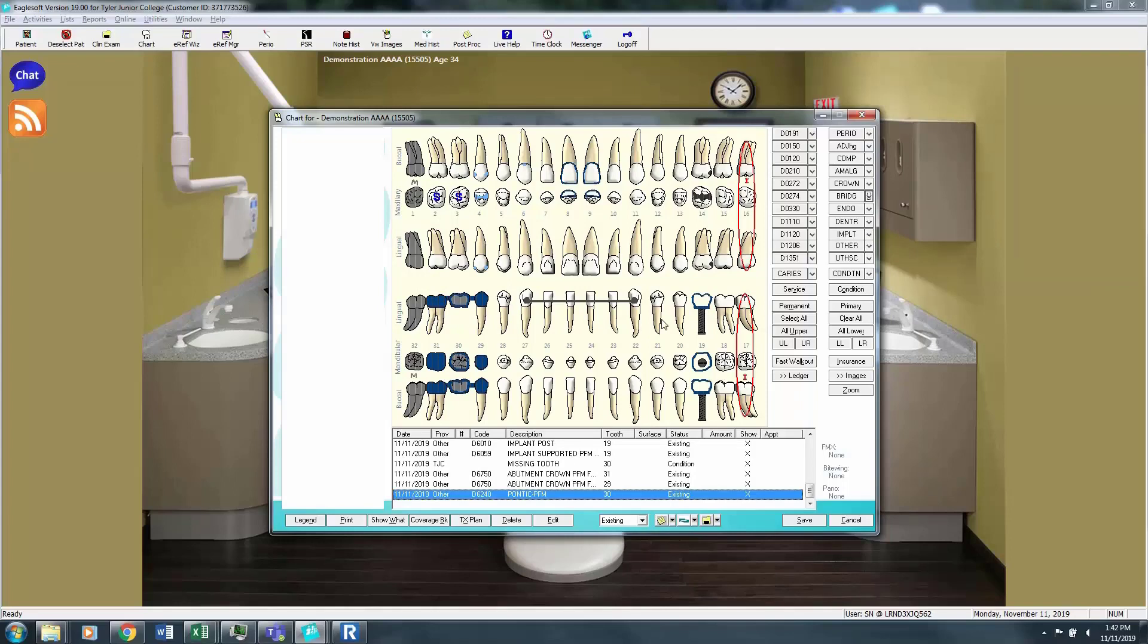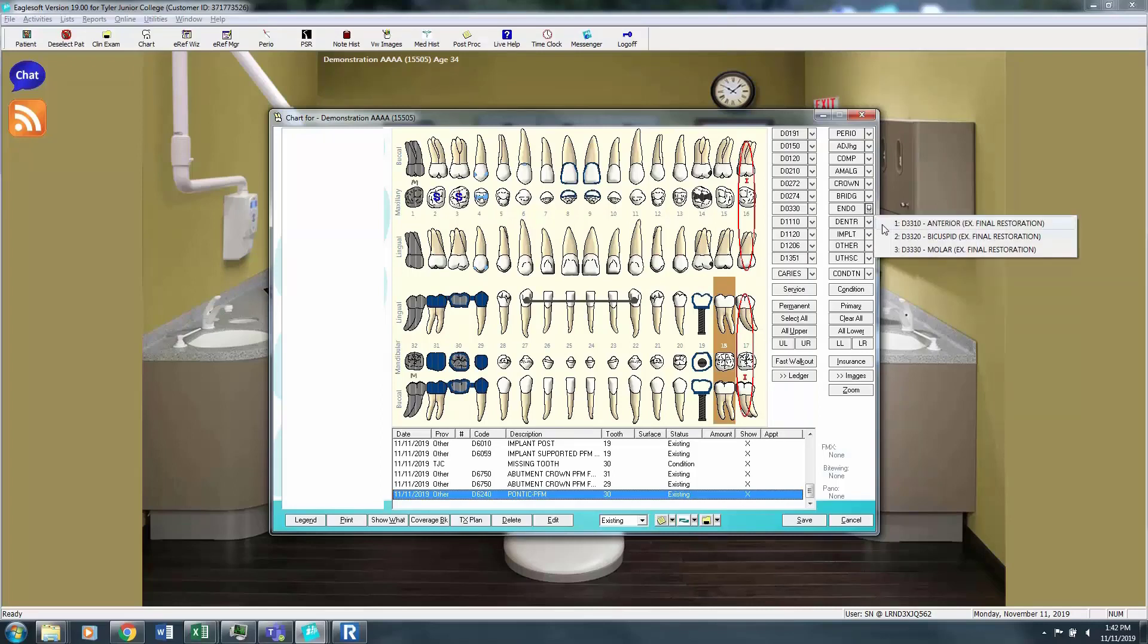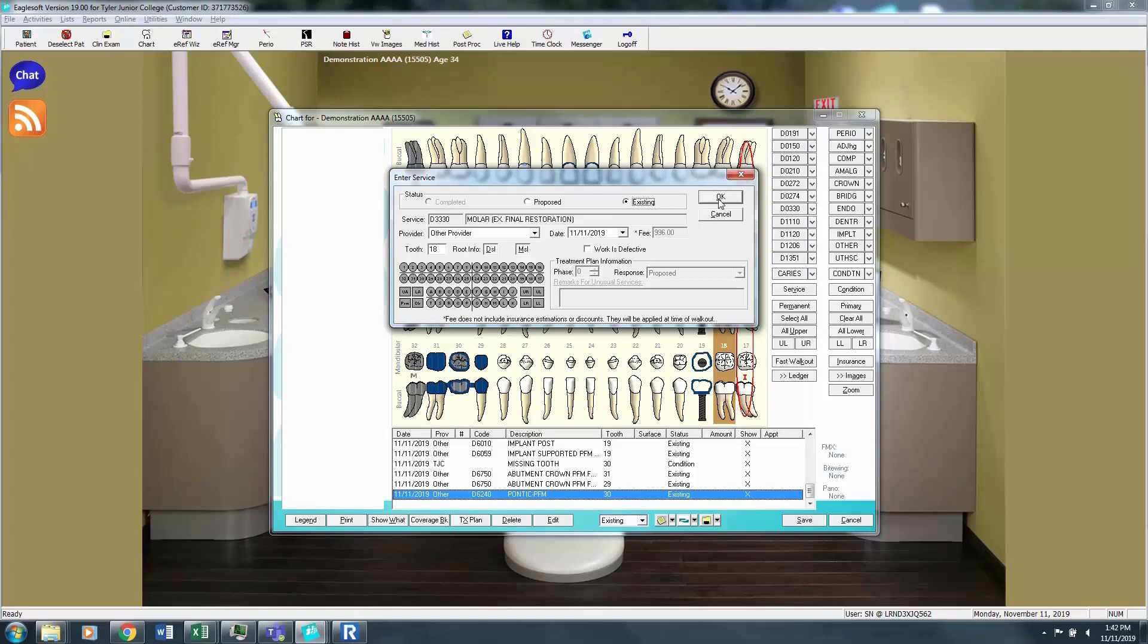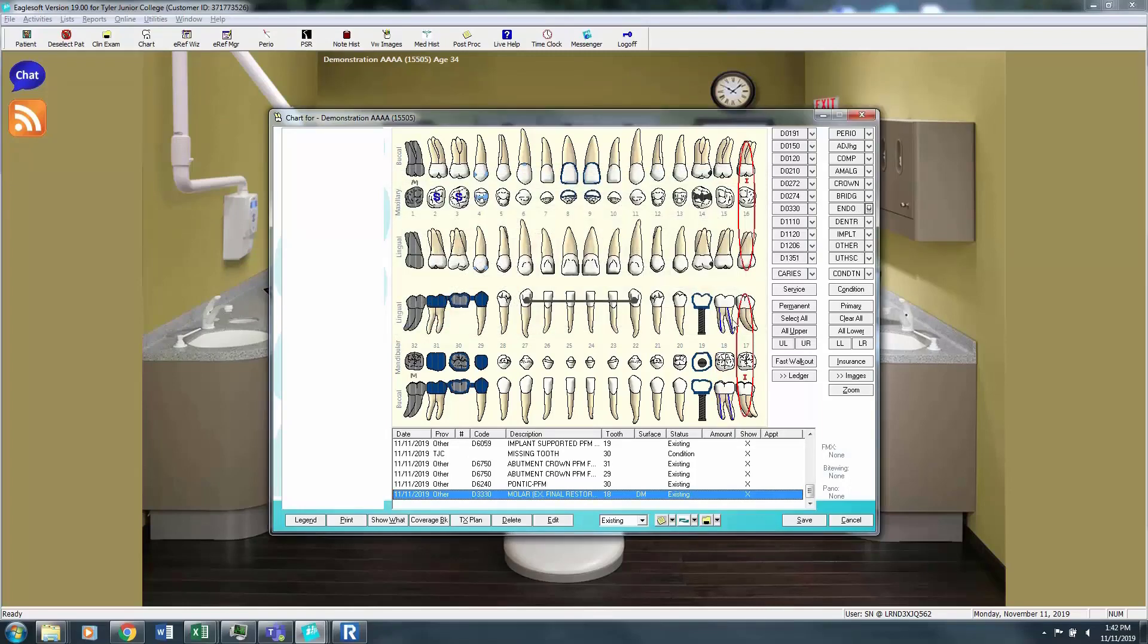To do a root canal, we'll click back over here on number 18. We're going to click endo. And here you get to choose is this an anterior tooth, a bicuspid, or a molar. You can also choose which root. So if a root canal has failed, this is where selecting the correct root would become important. So we're going to say this patient has an existing root canal and a full gold crown.